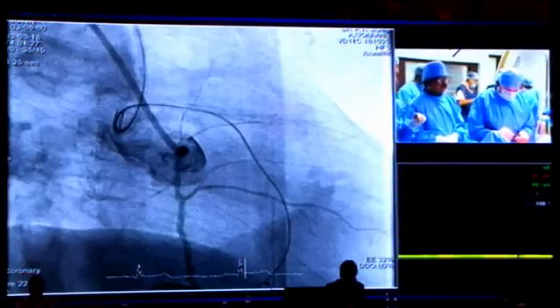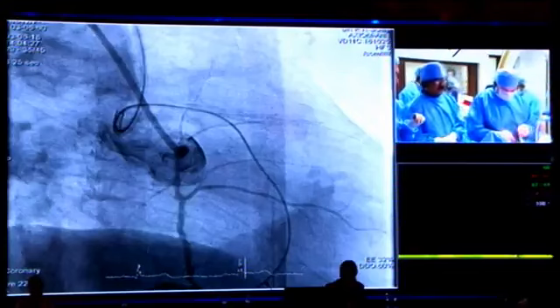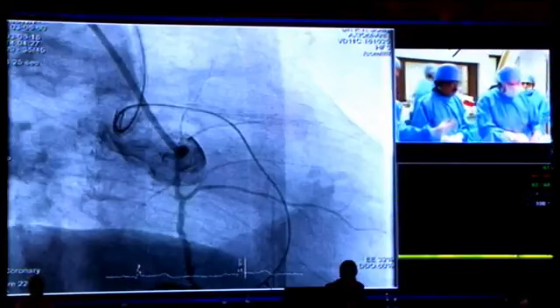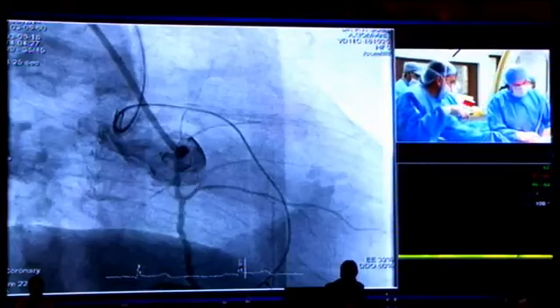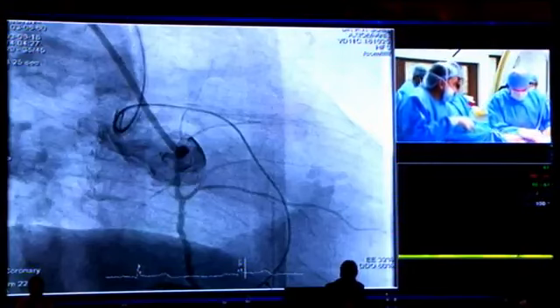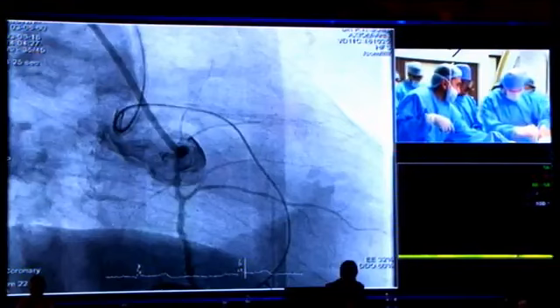Dr. Goyal, excellent. You demonstrated the retrograde true lumen, you entered into that, and you had to stent it. And the previous case from Hyderguda, they wanted to show it. Can we shift over to that? Hyderguda Apollo?